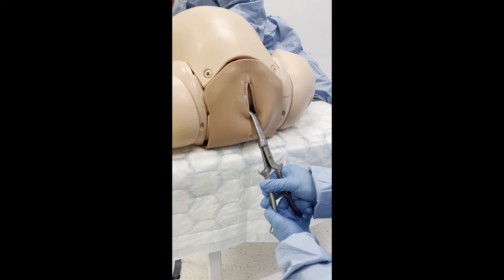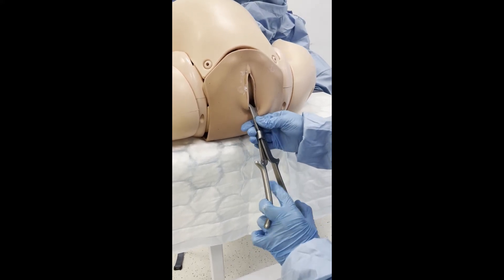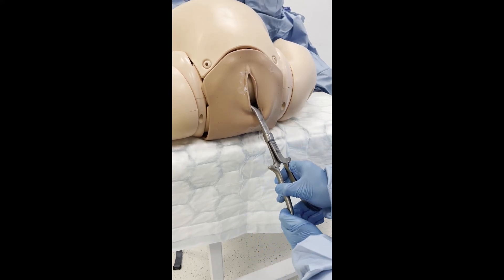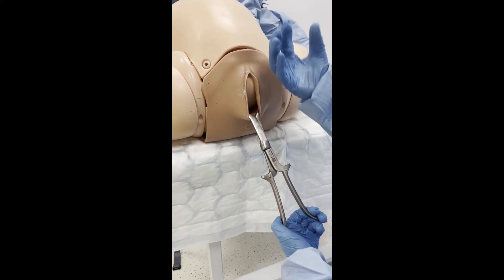Rotation is then performed between contractions, using no more than fingertip pressure. The procedure should be abandoned if any difficulty is encountered. Check fetal position again after rotation — it is now in OA.